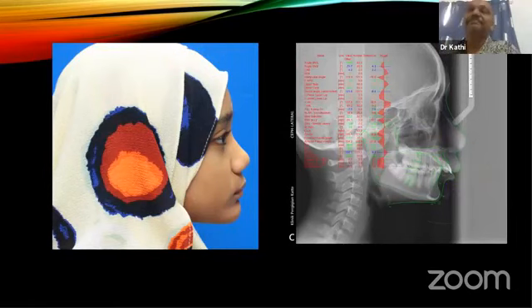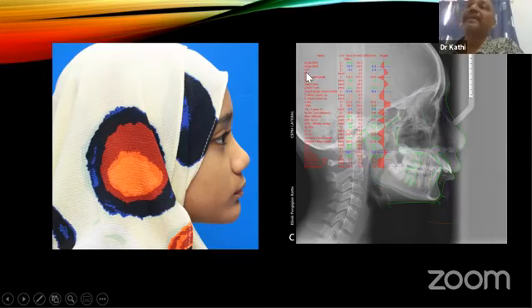Like this case, the patient had ANB of 4.2 for Wits analysis. Wits analysis is another analysis to show the degree of discrepancy in the sagittal dimension, because ANB suffers from inadequacy when there are compounding vertical problems.